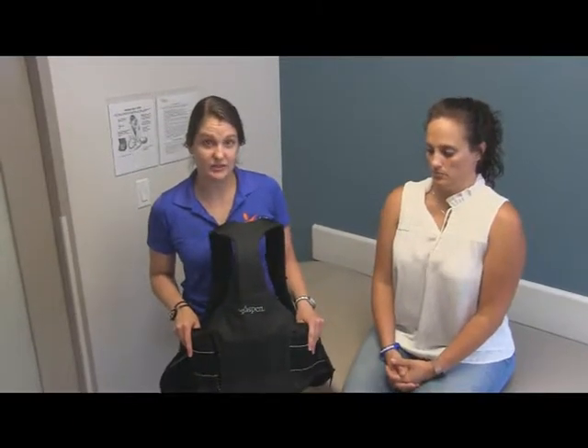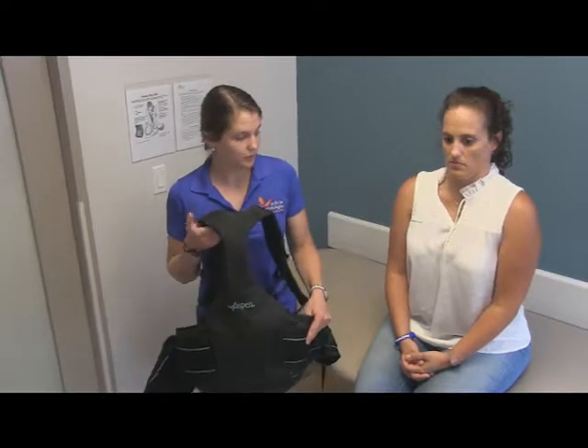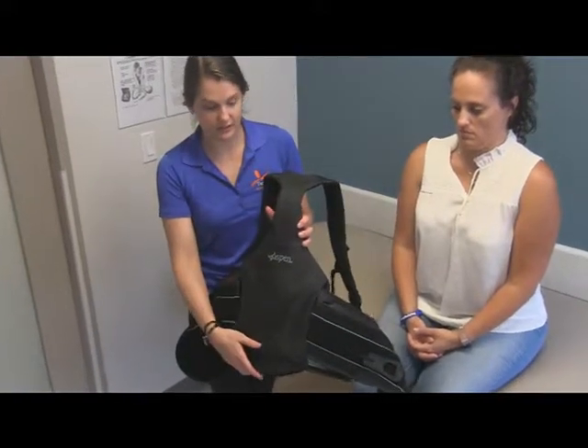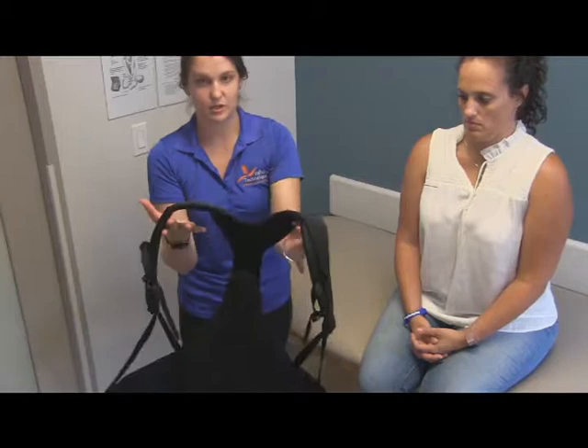We are going to be fitting the Aspen TLSO with a patient that is able to sit up on their own. This brace is aligned so that the back portion with the Aspen logo goes in the back. In order to put it on, these shoulder straps go on just like a backpack.